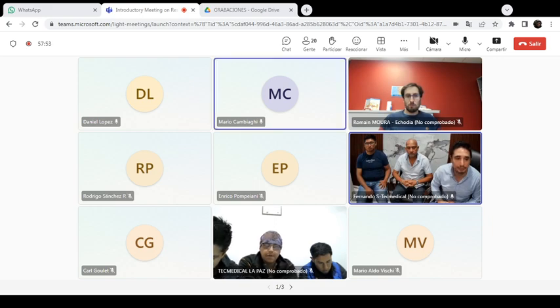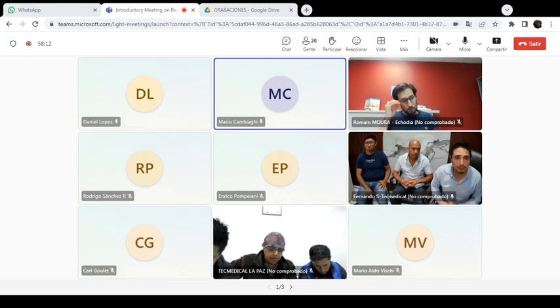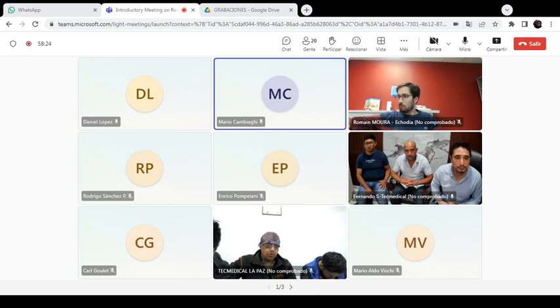No es molestando, y estamos disponibles. Es un placer, no es un problema. Estamos aquí. Vamos a ver si busco las palabras correctas. Para nosotros también es importante que usted haga todo lo que necesita para un mantenimiento correcto de los dispositivos, porque para vosotros sería muy importante ofrecer un servicio muy bueno, y para nosotros como marca es importante que todas las unidades funcionen correctamente.